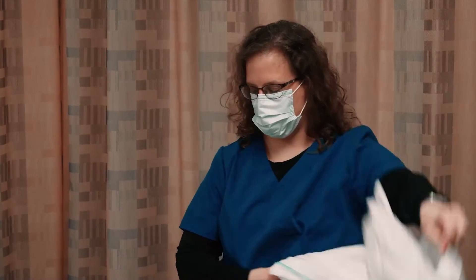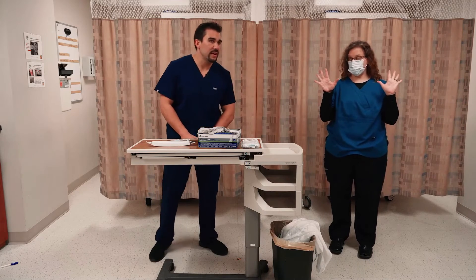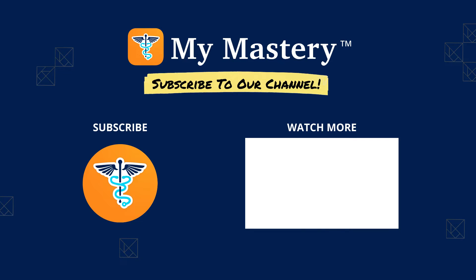And then once we're out of the patient's room — if they have an airborne disease — we're going to be taking the mask off with clean hands.